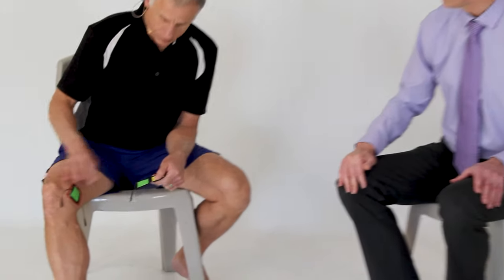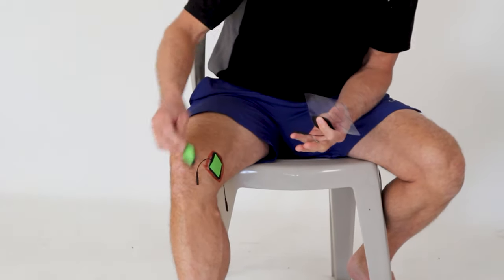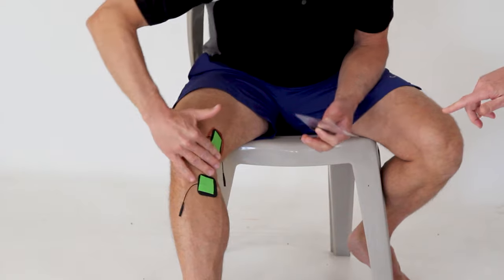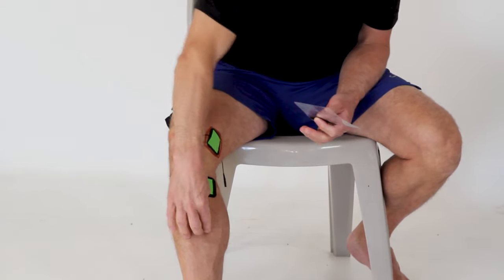So we're talking about medial knee pain, or pain on the inside of the knee. The first thing we would suggest is that you put a pad right on the knee pain. If it hurts right there, I've got a red mark there if you can see that. I'm going to put that pad there. I'm going to take the second pad from the channel and see how it goes below it. Right there. You look at how much of a gap he has there. He has at least a width of a pad between the two. And I wouldn't go down here.